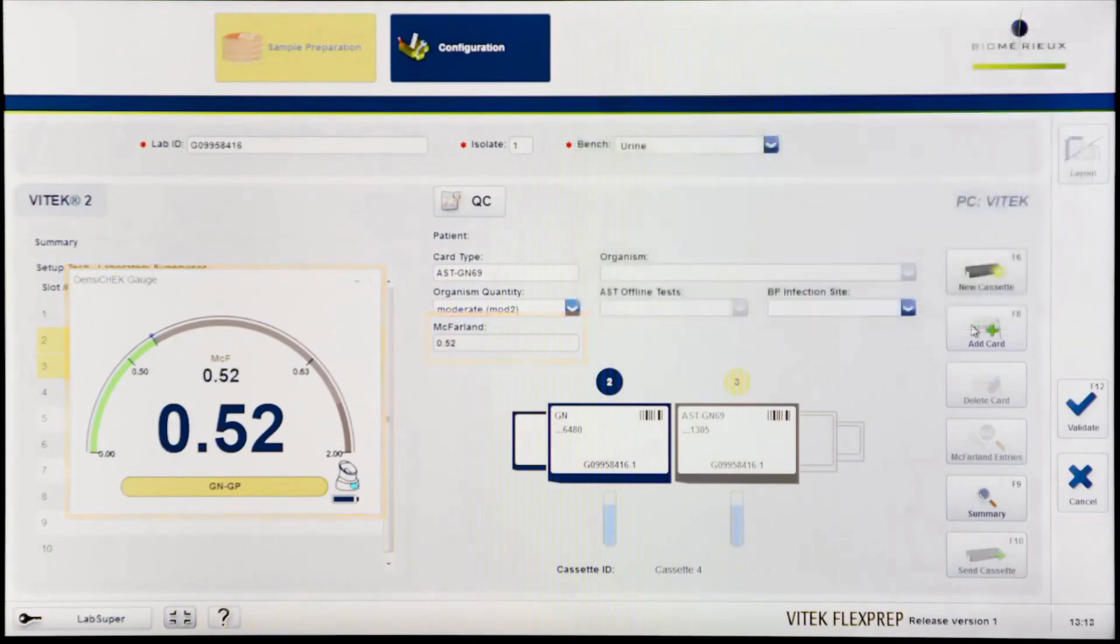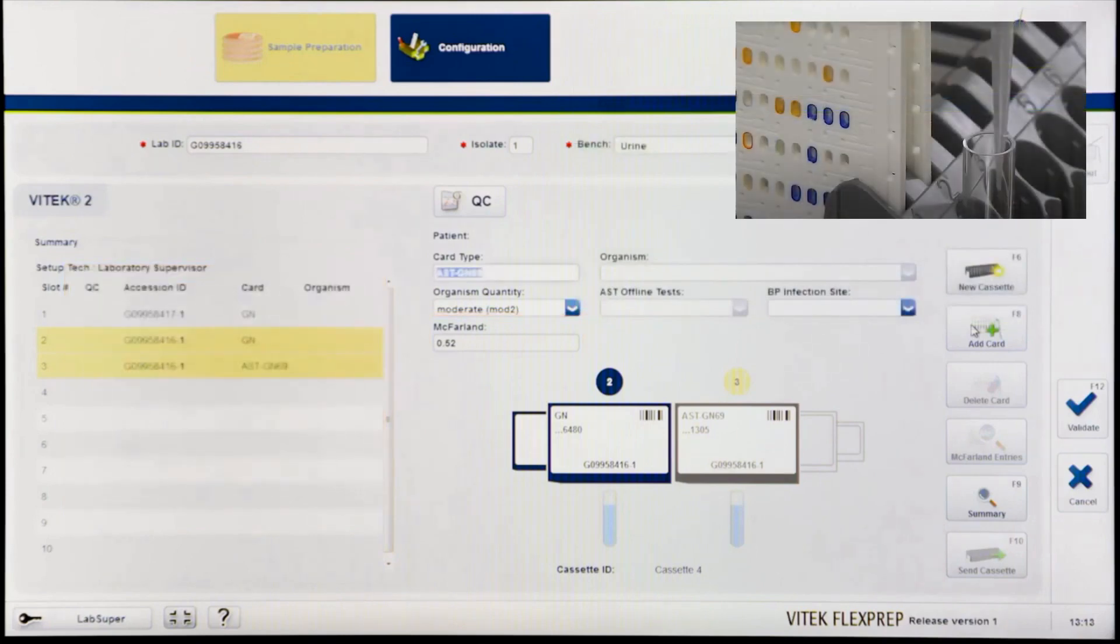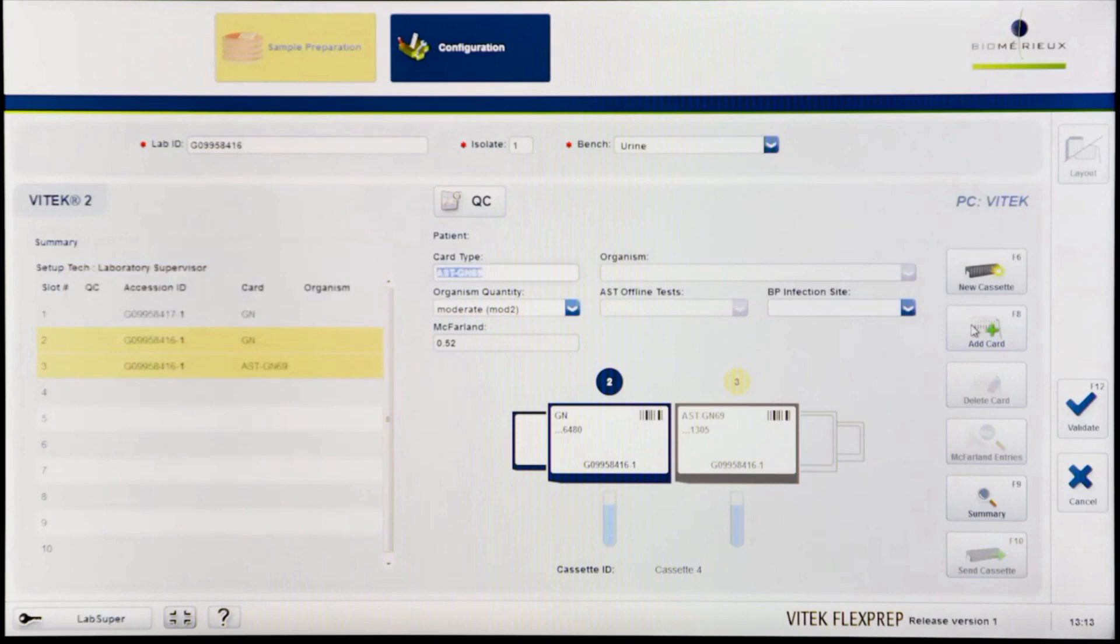Once the ID suspension has been created, make the associated AST dilutions. Repeat the process for adding another card if an extension AST card is being utilized.